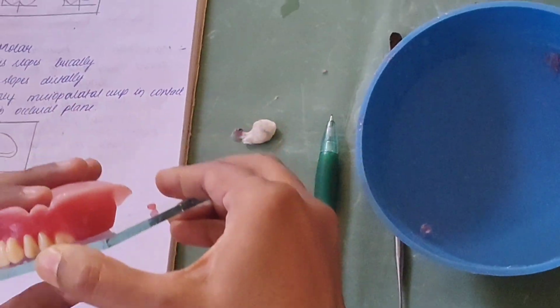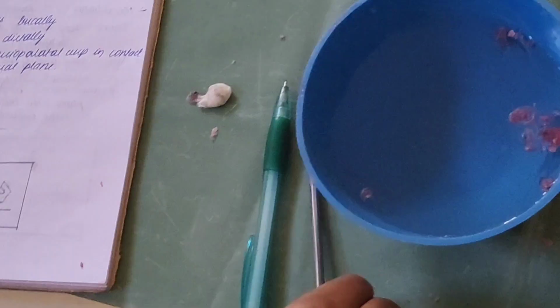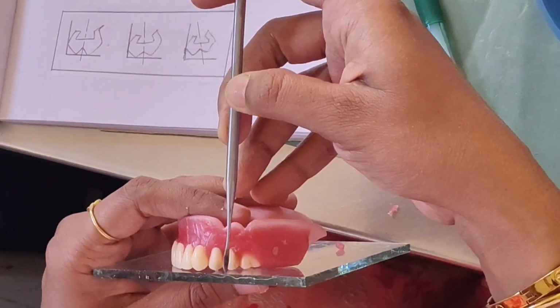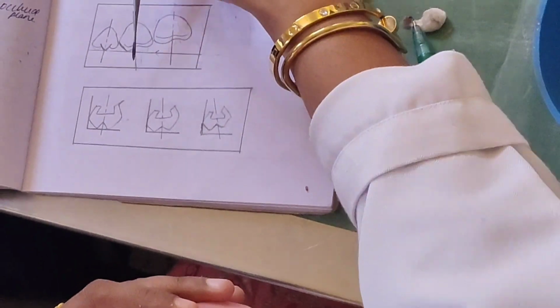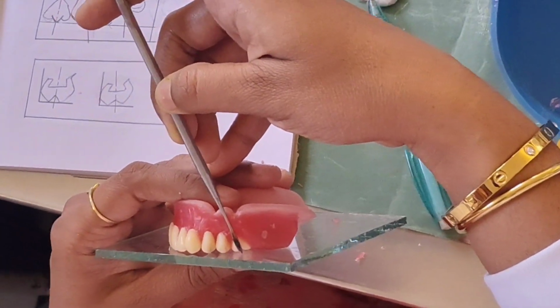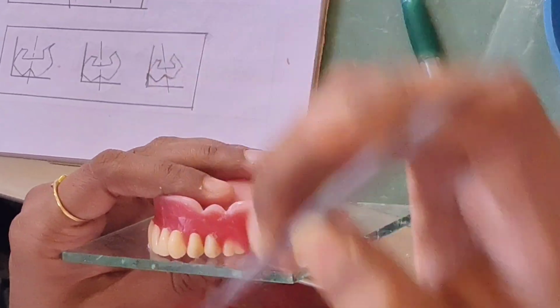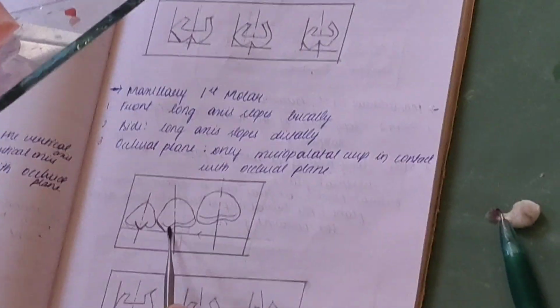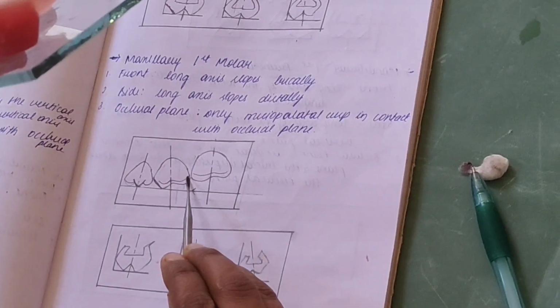So see, when we see buccally, the molar angulation won't be straight like the premolar angulation. This won't be straight, this will be tilted towards the mesial side. From buccally, the buccal cusp will be a little above.